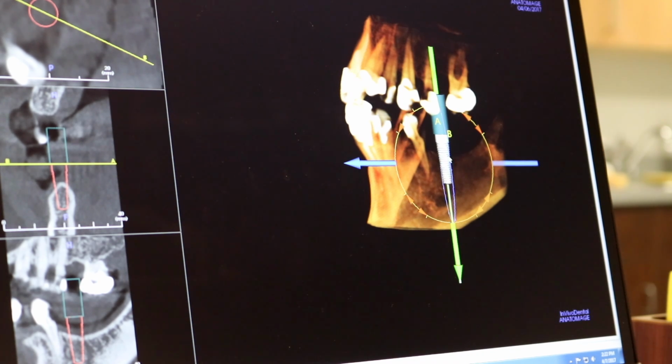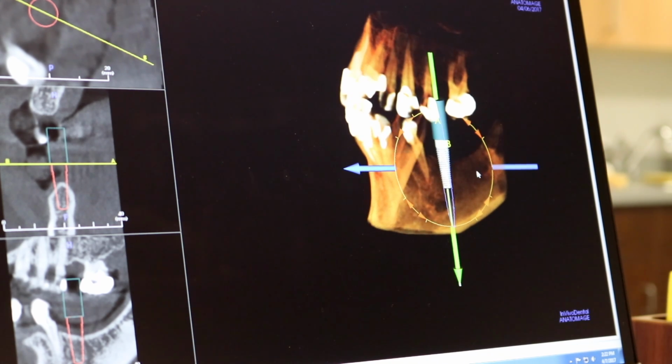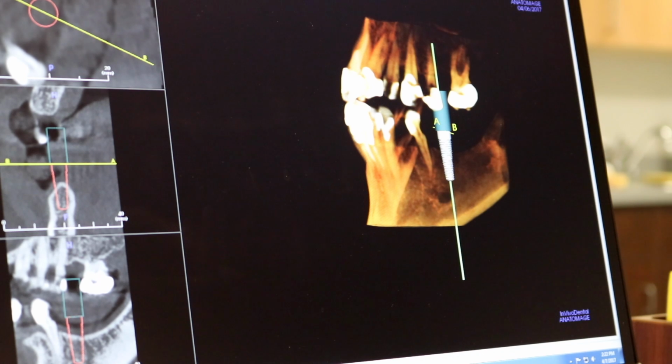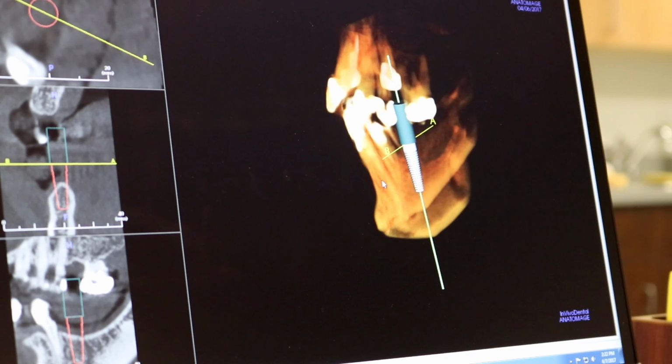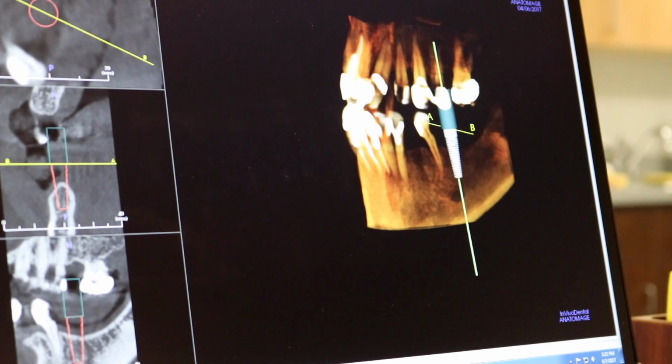What this does is it allows us to treatment plan this so that we can precisely place the implant, thereby avoiding important anatomical structures such as nerves, arteries, veins, and the sinus. A lot of people ask, is it necessary to have a cone beam image done? I don't think it's necessary, but if I were having an implant placed, I would probably want one of these done on myself, especially if it's a more tricky situation.